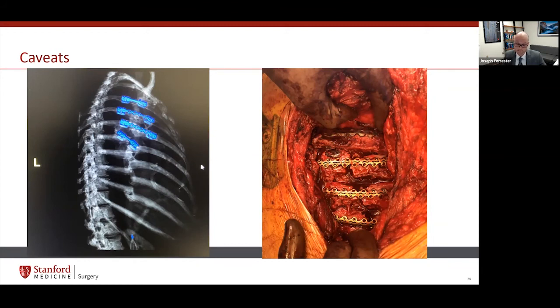To address her pain, I took her to surgery, re-broke all of her malaligned ribs, removed the broken hardware, and then had to replate and shift up her entire chest wall. This was quite a challenging operation, requiring many hours, and that I uniquely sterilize a vice grip through the flash sterilization. But now the patient is back to swimming and biking with minimal residual chest wall pain.